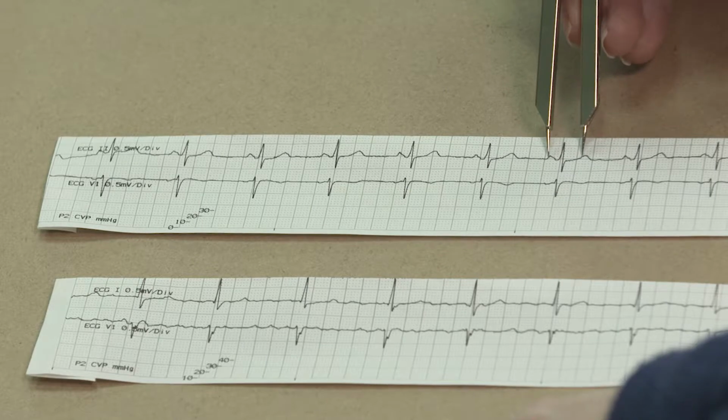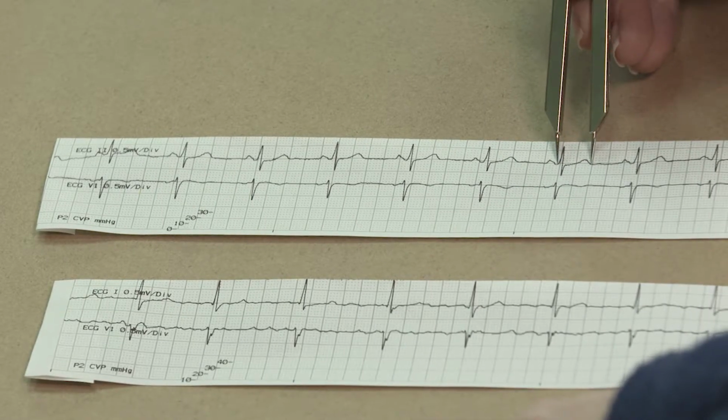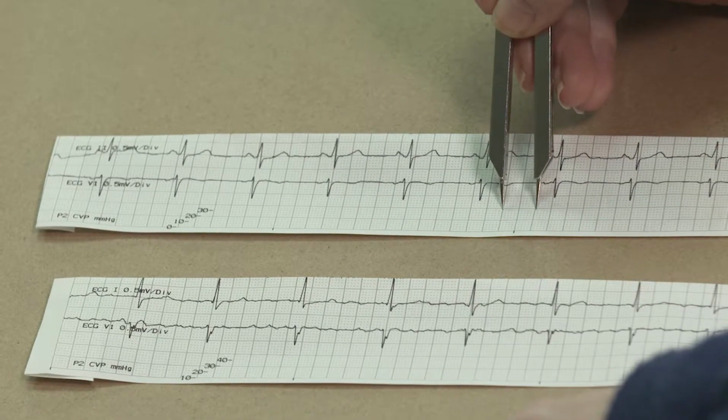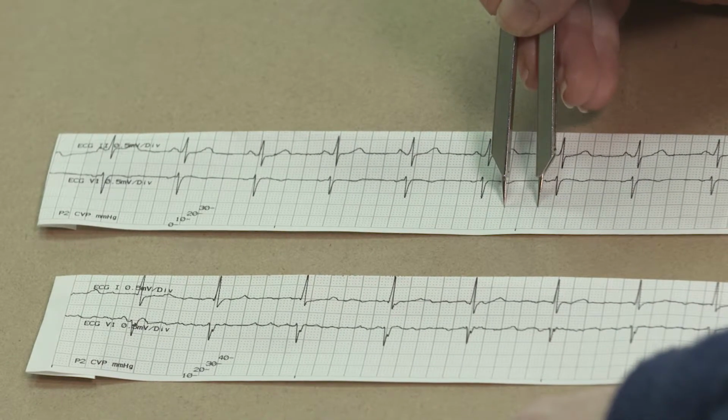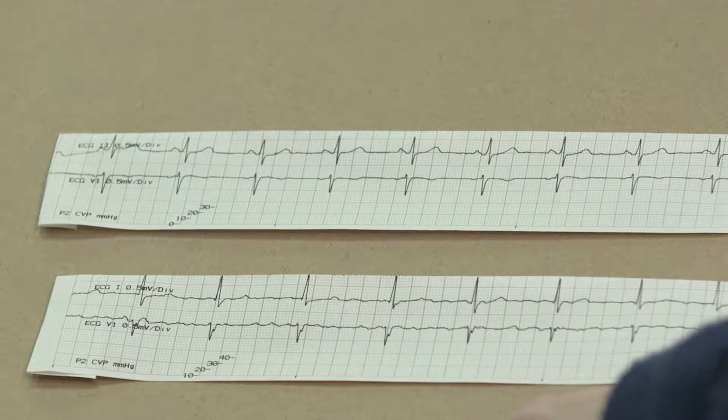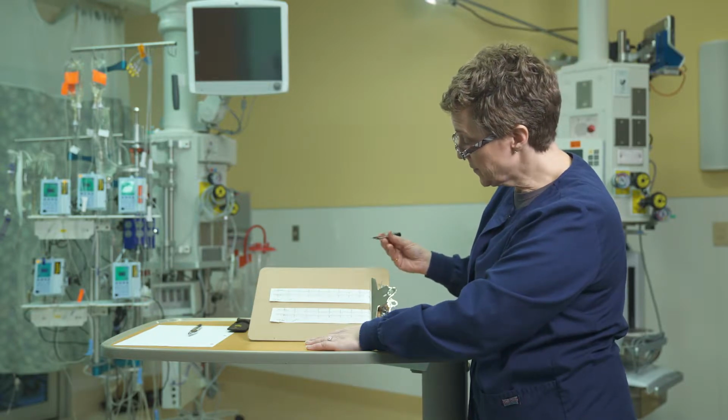Going across, making sure that it's consistent, which it is, down to that reference line again for an easy measurement. And this one's about 400, perhaps even 420 milliseconds. So all of those are still within normal limits.